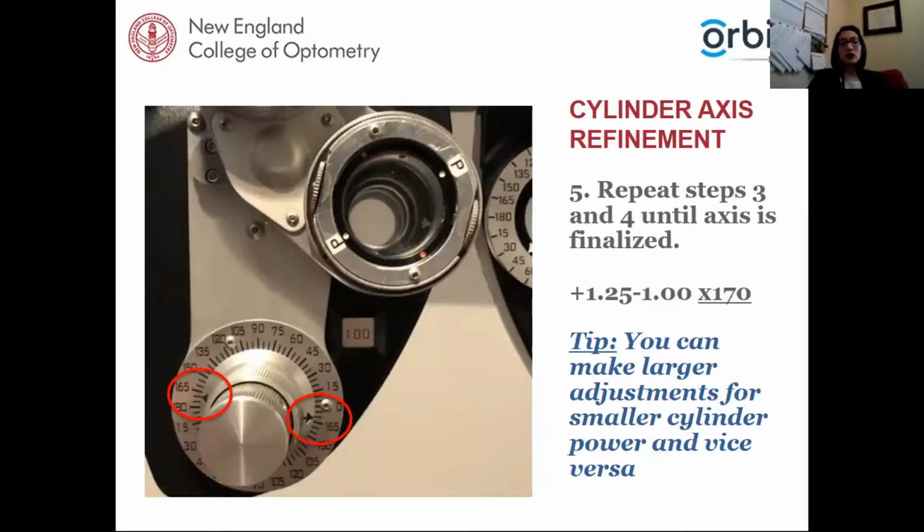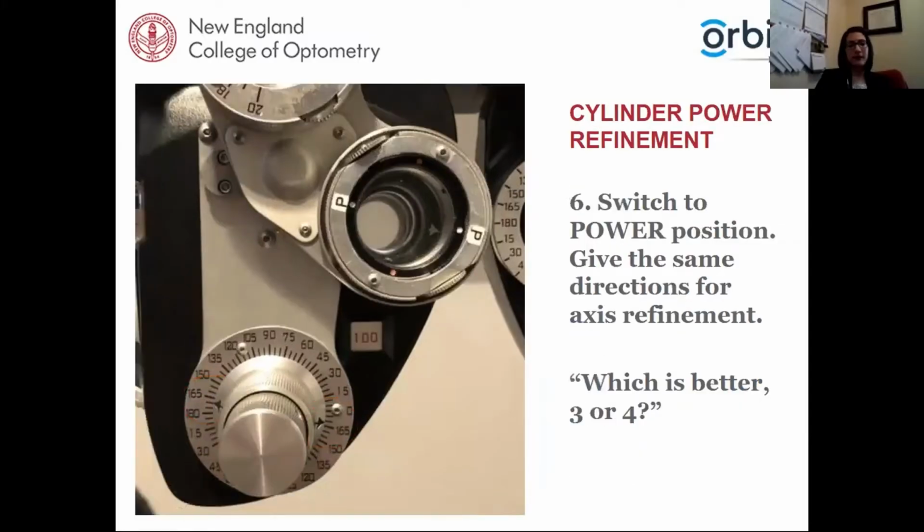But if you have a larger amount of cylinder, say 2 diopters of cylinder power, then I would make smaller axis changes, like maybe 5 degrees. And we'll see that in the example when we get to the left eye. So in this example, we've repeated these steps, and now we've finalized our axis to be at 170 as opposed to the 180, which is what we found on our retinoscopy finding.